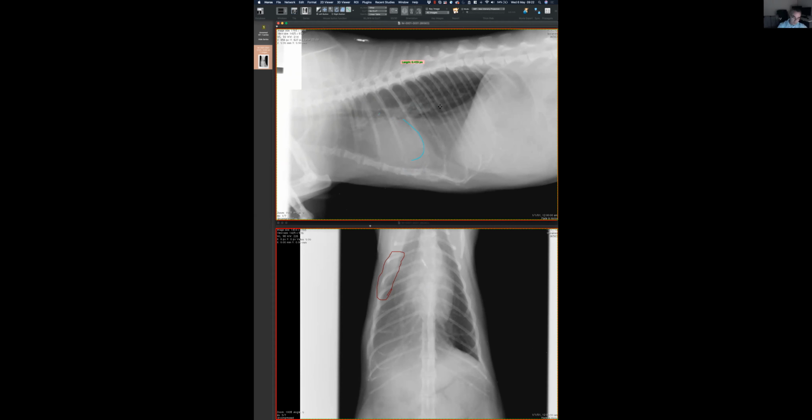And now I have a second challenge for you. It's the challenge of how can you explain this if you are putting that in the lung? Make sense? Well, in the book, one of the features of the alveolar pattern is going to be a wet lung. So I like your point. Basically, instead of saying this is an alveolar pattern, what we are saying is that the increased opacity is within the lung. You can even ignore how to call the pattern. You are saying the lung is the one that has the increased opacity.